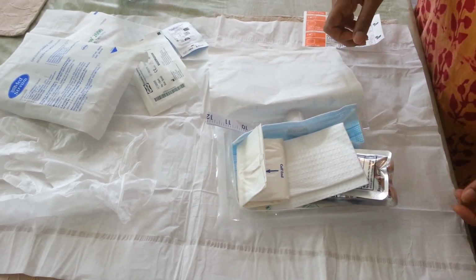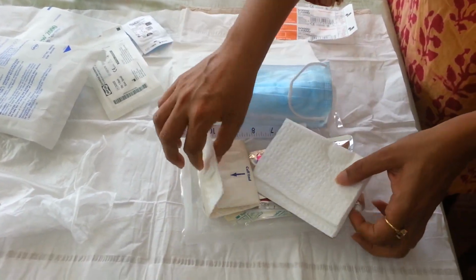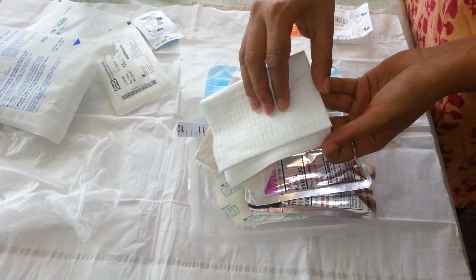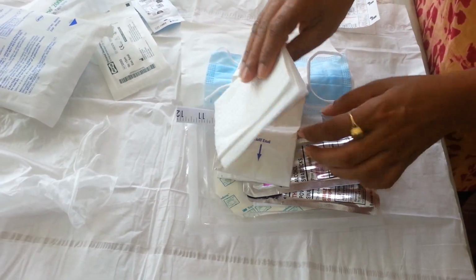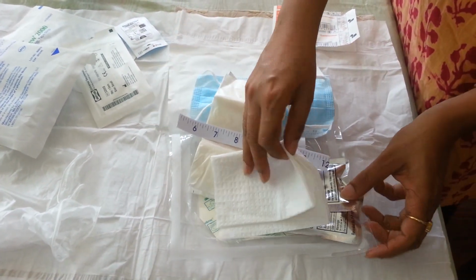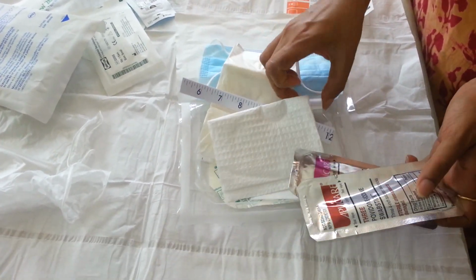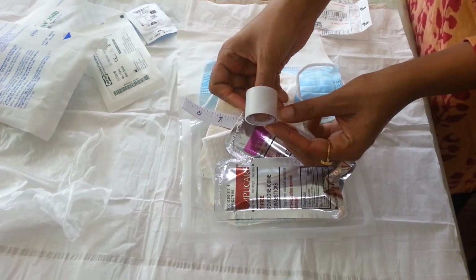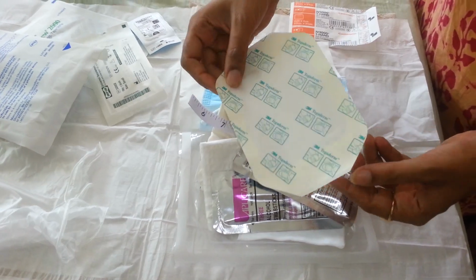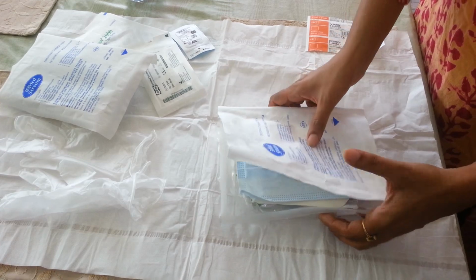For example, a mask, a pair of sterile gloves, a sterile drape, a tape measure, alcohol and PVP swab sticks, a tape roll, and a Tegaderm dressing. So we will keep this kit aside since we are not going to use it.